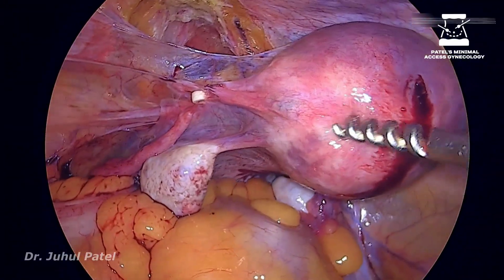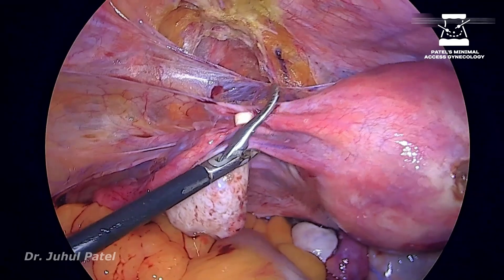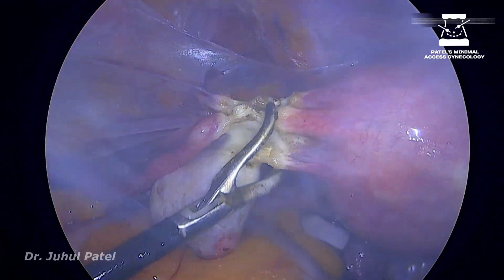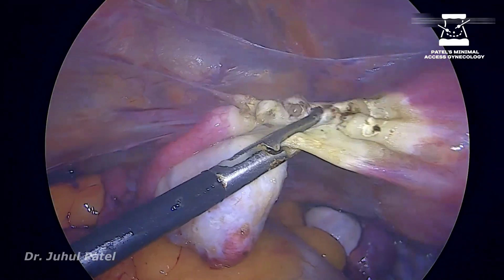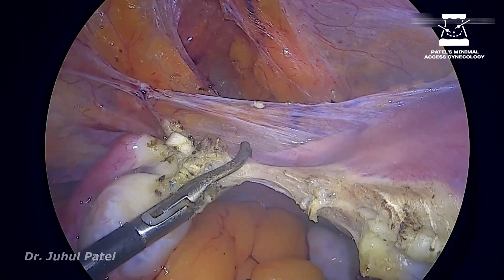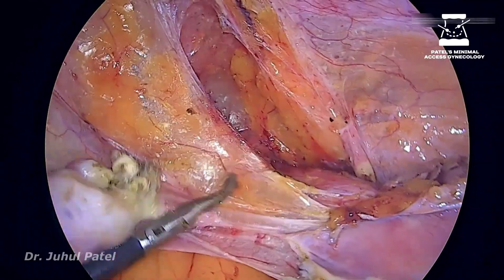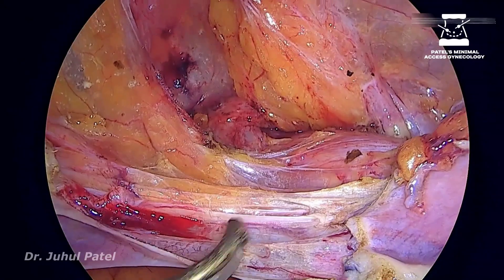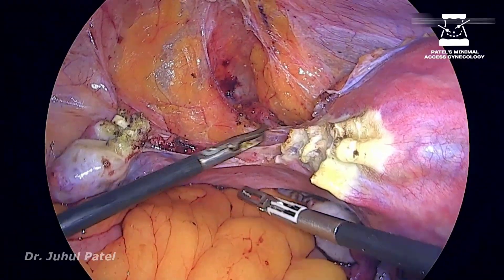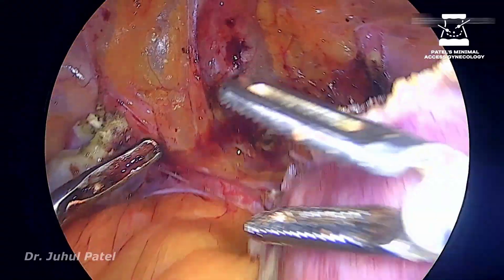Switching to the other side — my camera will come from the right and come closer to the left cornual structures. Again sealing at three different locations and then cutting in between. I will keep on chopping both leaves. These are just bladder adhesions which need to be chopped off. Once you have reached this level, remember all the tissue above the level of vessels needs to be chopped off — it belongs to the bladder. I can see fat, so I will keep on chopping all the tissue below to the level of fat.